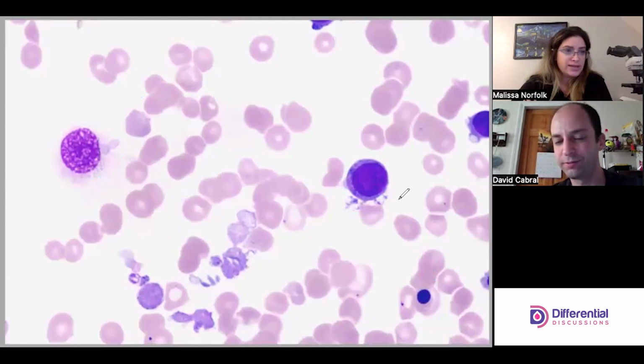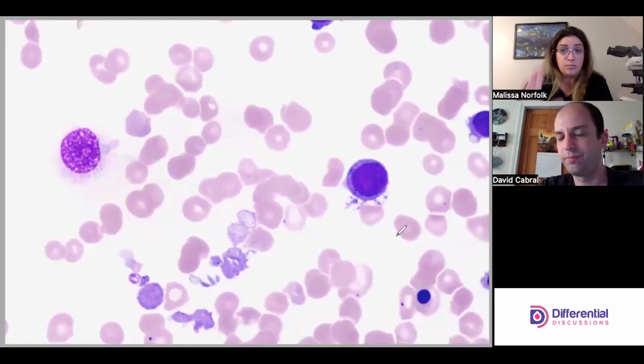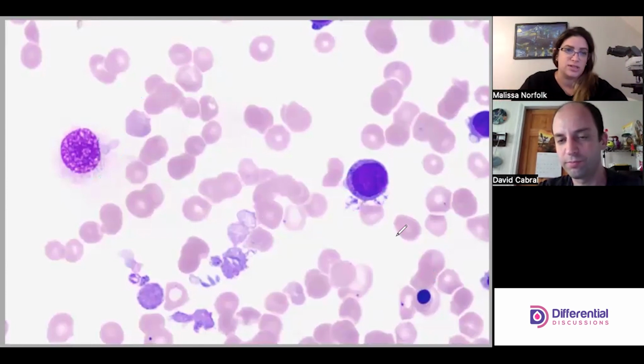Like I said, each case is going to be different, and flow is going to really dictate what these cells are. So for this cell in particular, it's an abnormal, malignant, teeny tiny megakaryoblast. Remember, megakaryocytes and blasts are usually ginormous. This one and its clones are going to be very teeny tiny, and that's just this case in particular. These are counted as part of the 100. They just have to be their own category. So yeah, this is a really bizarre one.